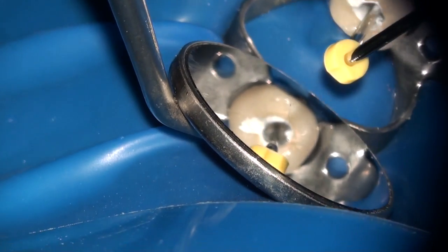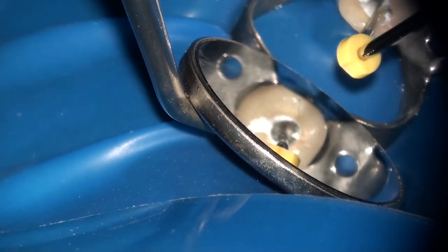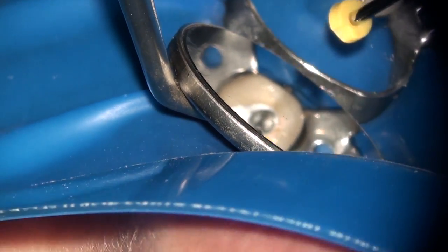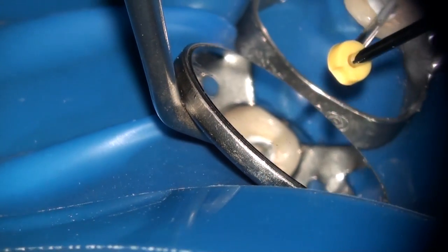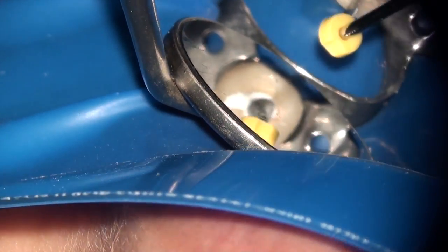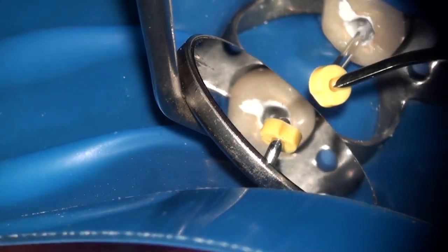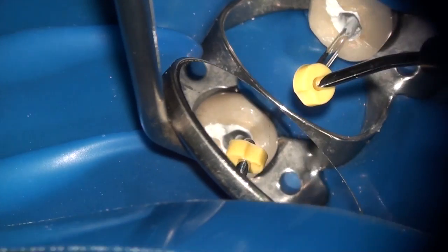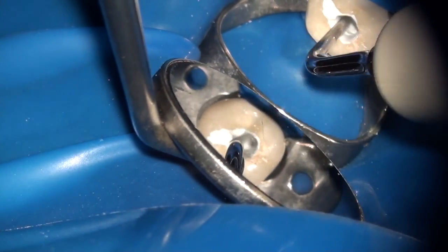Once the gutta percha has been seared off, a plugger is used to condense the gutta percha at the mid-root level. It's important not to place too much pressure on the dentinal walls. The goal is to only condense the gutta percha down to get a denser fill. Towards the end, you want to walk your condenser down 360 degrees around the perimeter of the molten gutta percha so that you can get a fairly close adaptation to the canal wall.